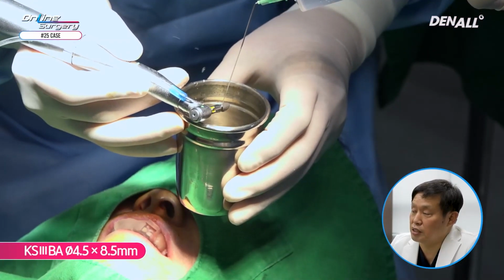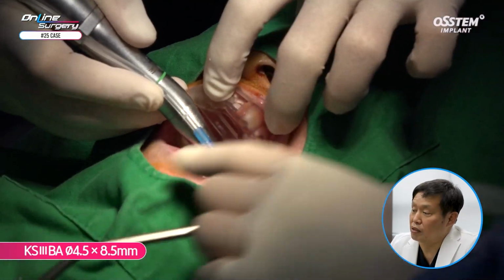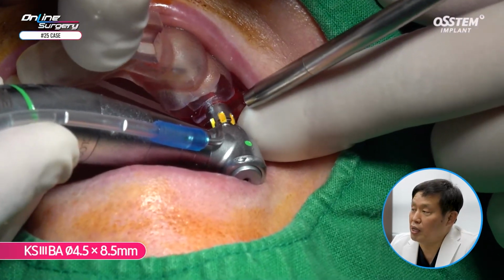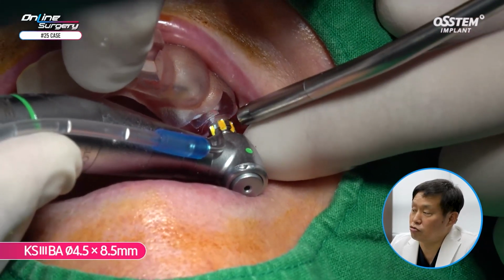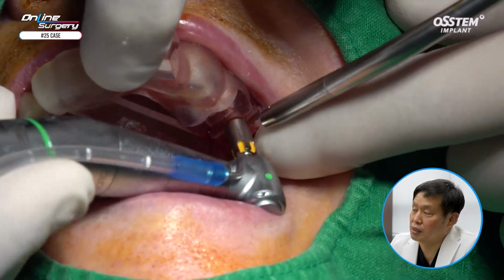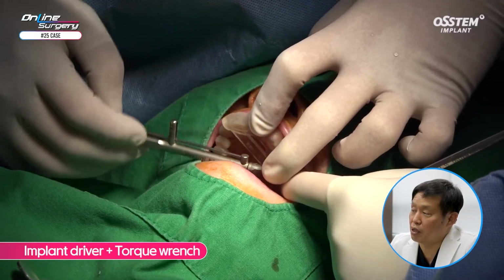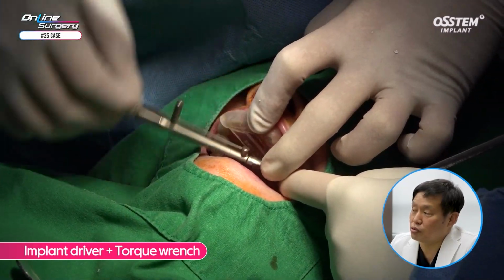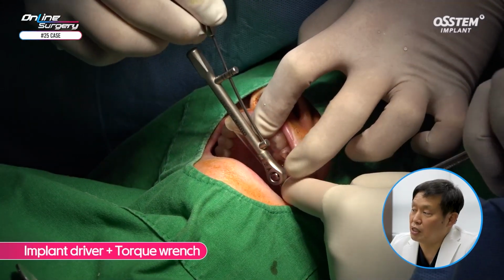KS3 BA surface, the 4.5 by 8.5mm implant is placed. Because it is BA surface, the saline is used to irrigate it sufficiently. The implant is placed about 80% using the engine. Primary stability is rather favorable and is over 30 Newton centimeters. It looks sufficiently stable.